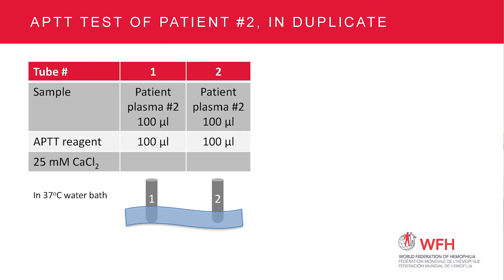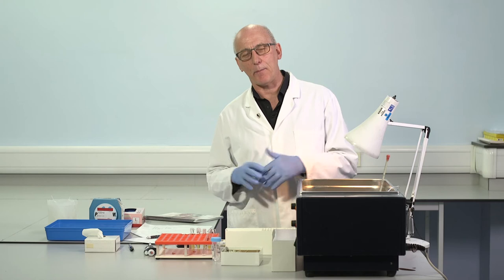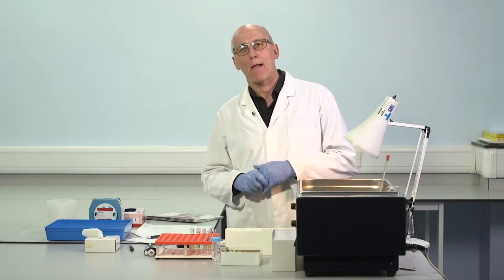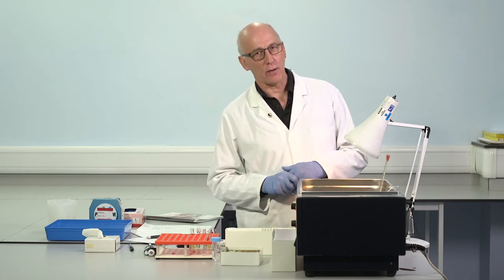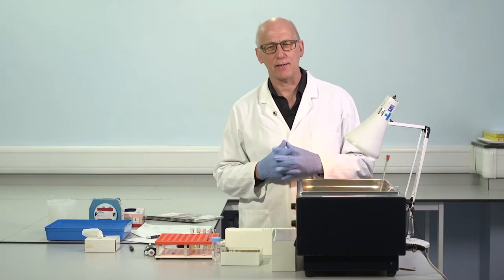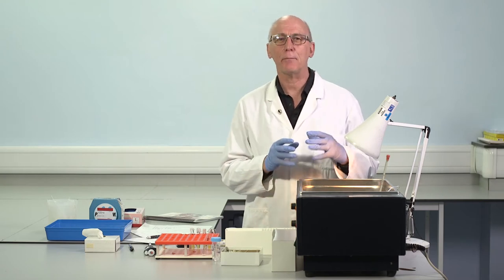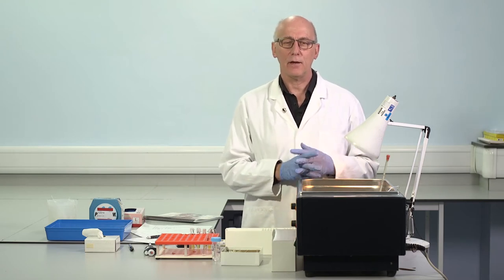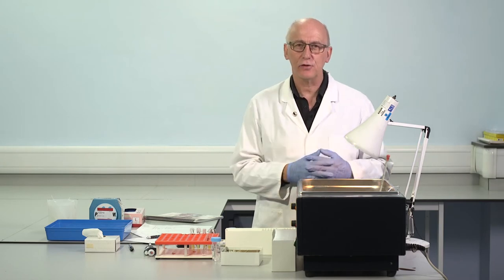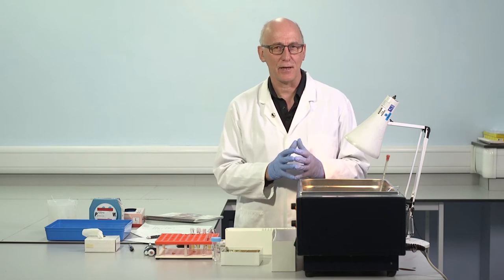Reference range for APTT is really important. We need that to make safe conclusions about patient result. It should be assessed locally, in my opinion, for APTT in particular, maybe above all other tests in hemostasis. It's really important to use a reference range which is established locally. Locally, using the same blood collection tubes, the same sample storage, the same centrifugation.